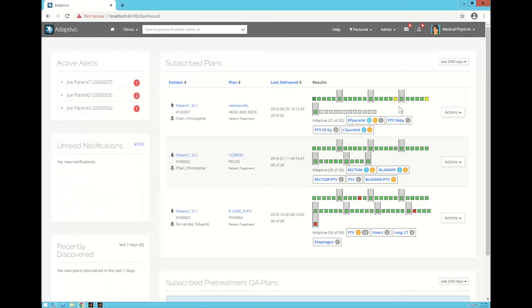Again, I wanted to then show you over here on the dashboard that I have. These are the chiclets that I've been talking about. So these 3 patients that I'm showing now have had both the in vivo module computed as well as the adaptive module.